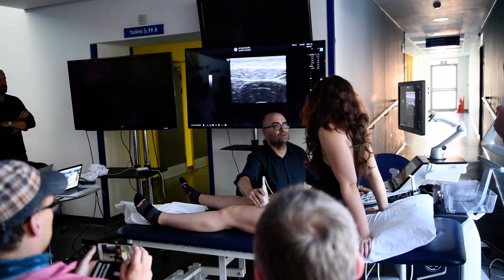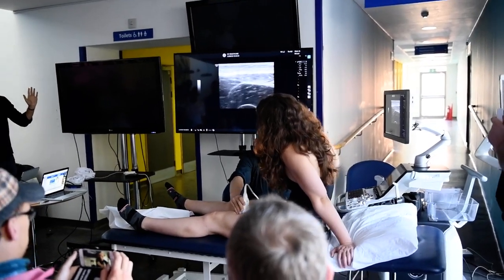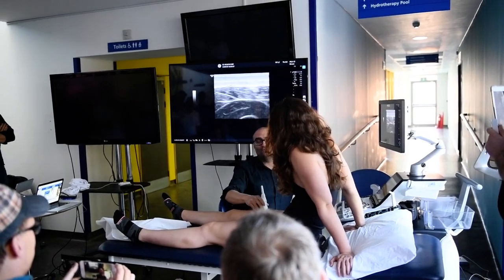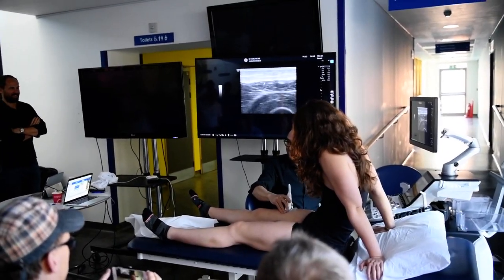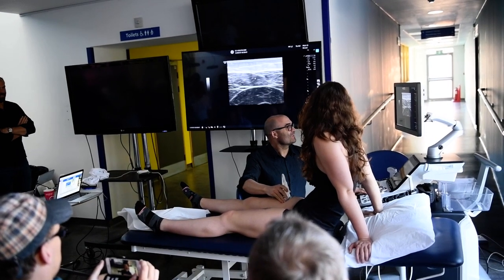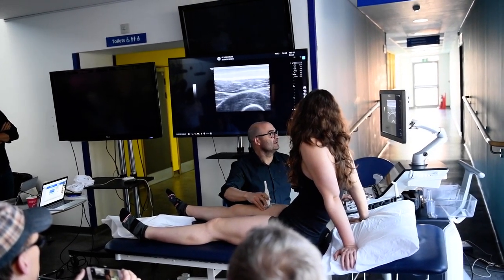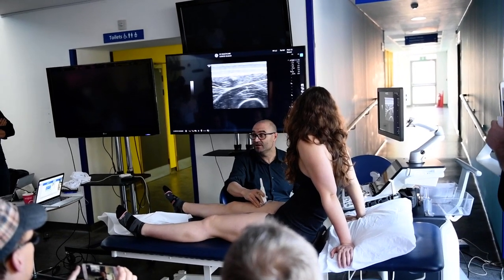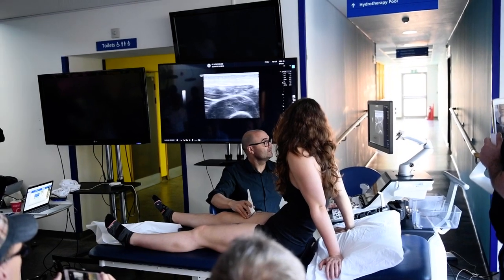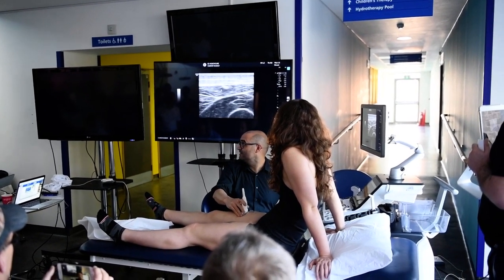You have an injury here also. That's why I invited him. Can you bring me a normal model, please? So normally you threw the probe into the rectus femoris central tendon. Here you have the central tendon more proximal, so the injury was more distal. And this is the way they have to heal — exactly this way. That's not a soft scar — absolutely not. This is a perfect scar.